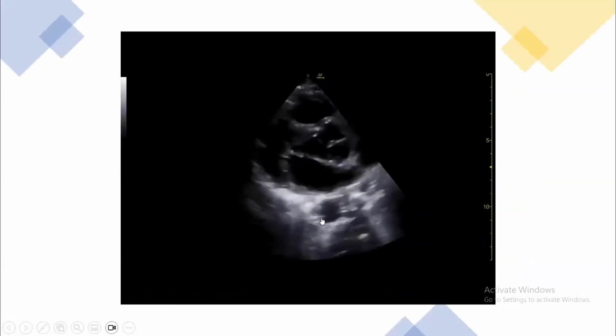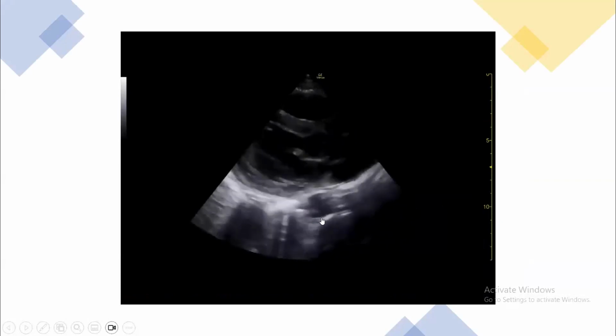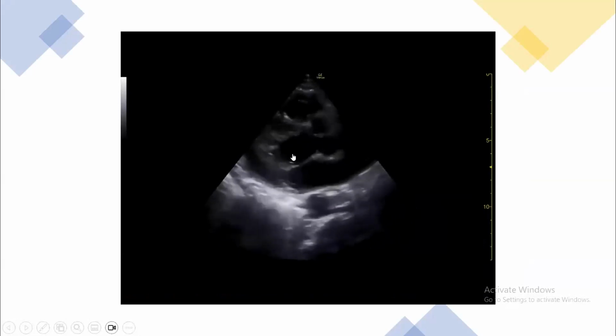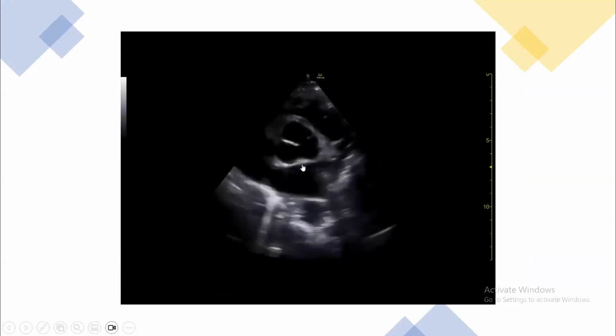Okay, this is a complete POCUS examination. You can see this is the parasternal long axis. The left ventricle is very well contracted. The mitral is touching the septum. Now coming to the short axis, I will stop here this time. This is a little bit advanced short axis at the aortic root, at the aorta, sorry, aortic cusp. Aortic cusp appears like the Mercedes sign.